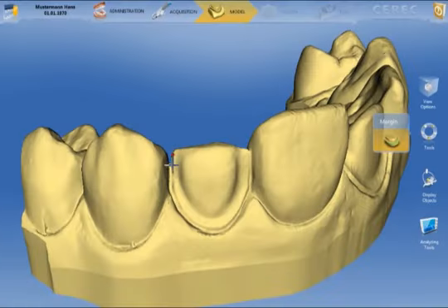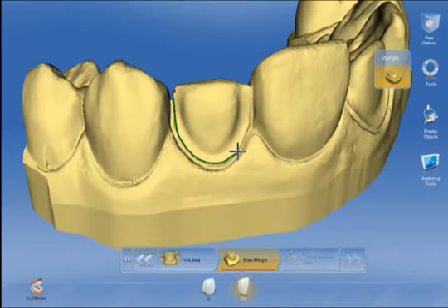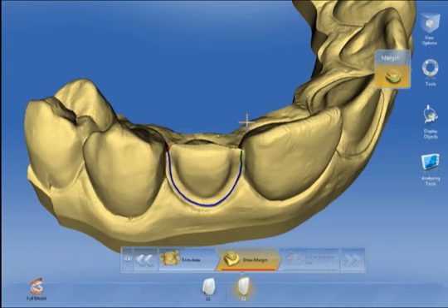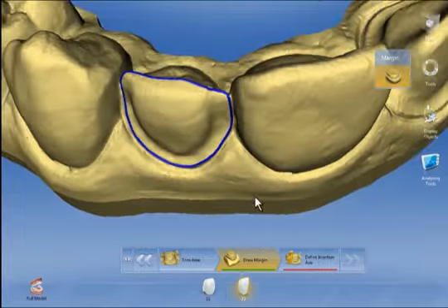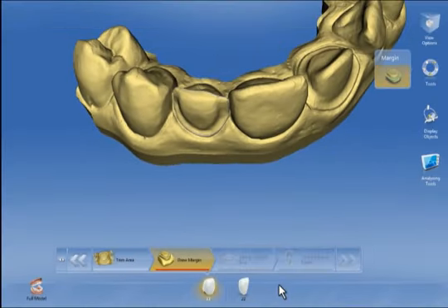In the model phase we enter the preparation margin for veneer 2-2. We start with a double click and then place only a few clicks along the preparation margin. The software automatically detects the margin and connects the various points. We check it and being satisfied, we proceed.